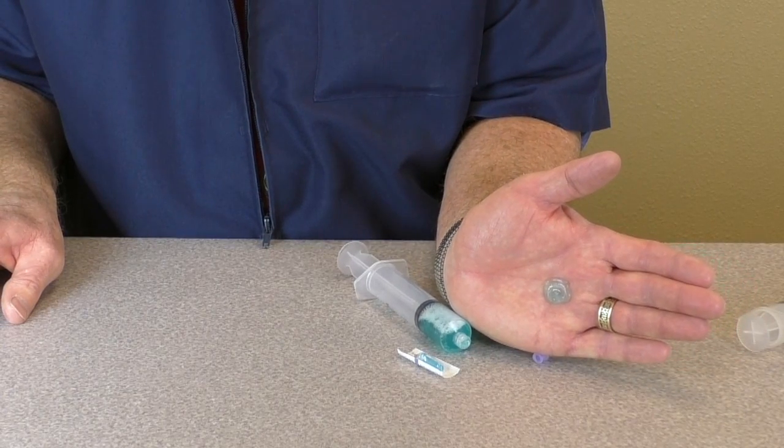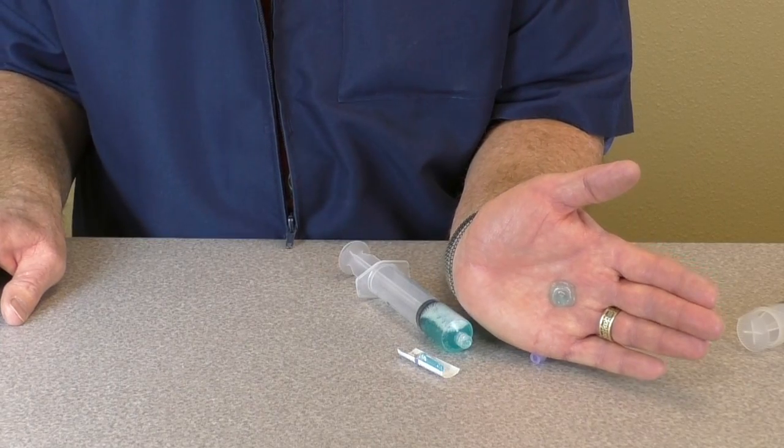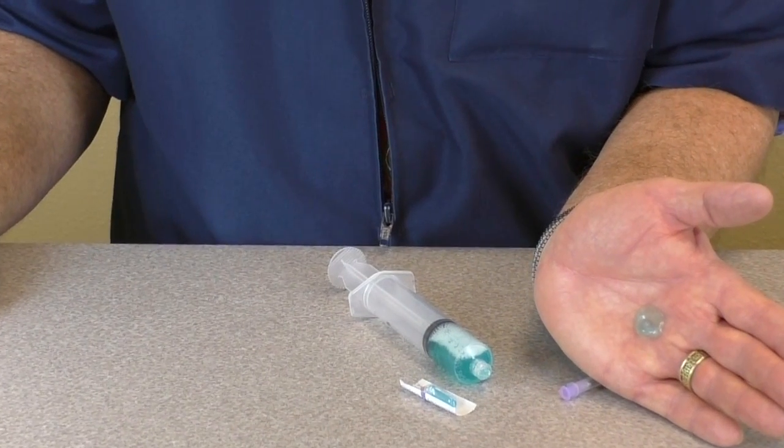Because of this, the admixture you are making will go so much easier if everything — including the syringes, needles and transfer unit — are all cold just prior to mixing.